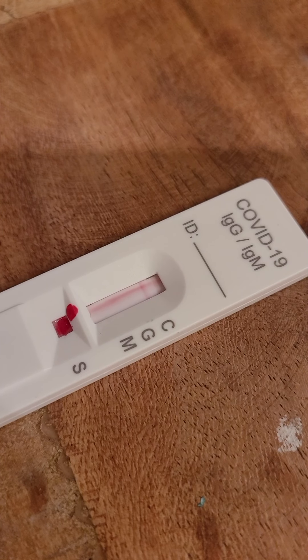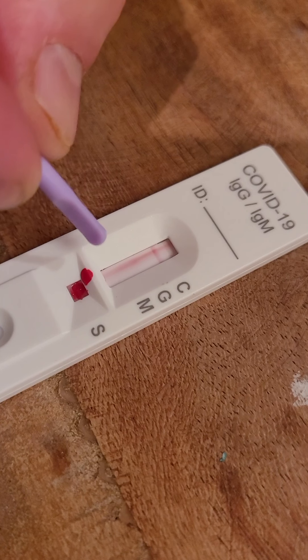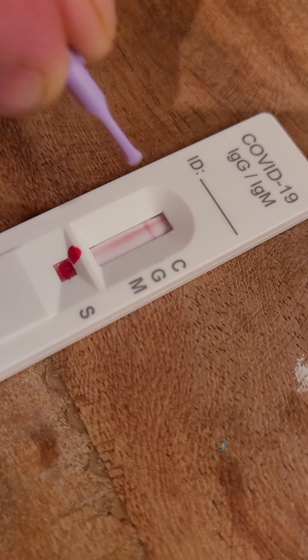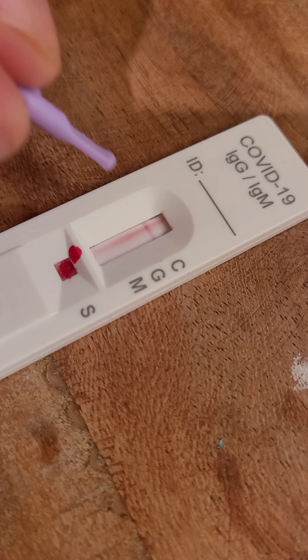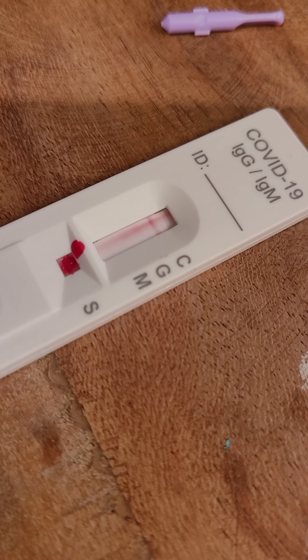So again, look on the thing: C is the control, that one has to be there. If that line just shows up then you're negative. If C and G show up, that means you have the antibody. If C, G, and M all show up, that means you have the antibody and you're positive for corona. So this shows that I am - you see it comes out. It says 15 minutes, but it pretty much shows you within a minute.